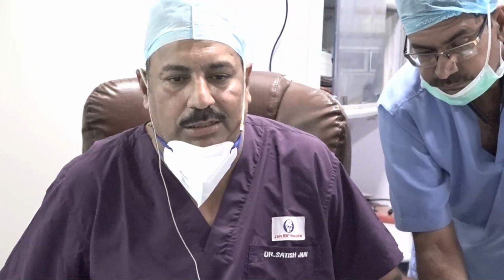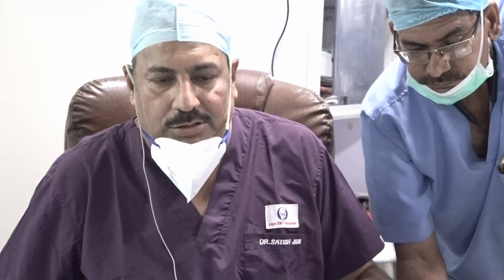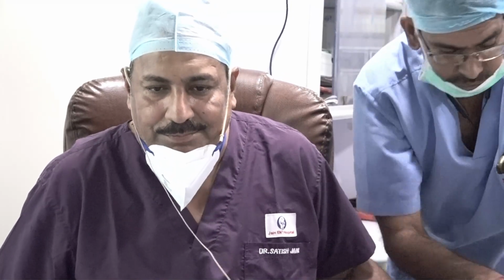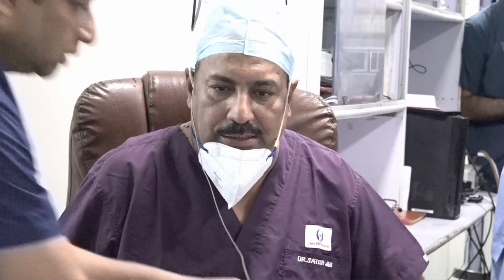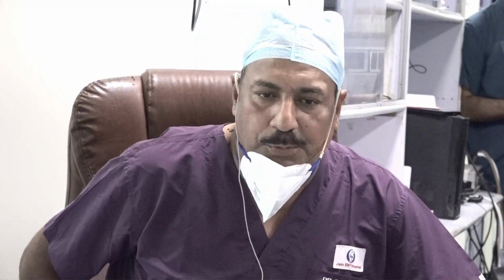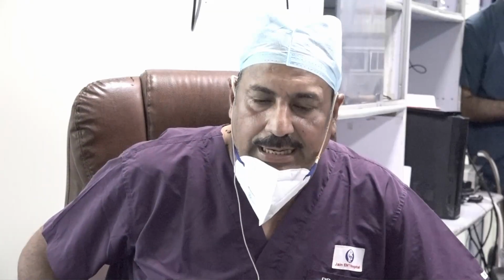Otherwise, we all are getting over 90% results. So this is a little bit more exercise to get better results. So I am starting the surgery for this patient. We have already done the post-aural incision. So quickly we'll discuss the surgical steps.